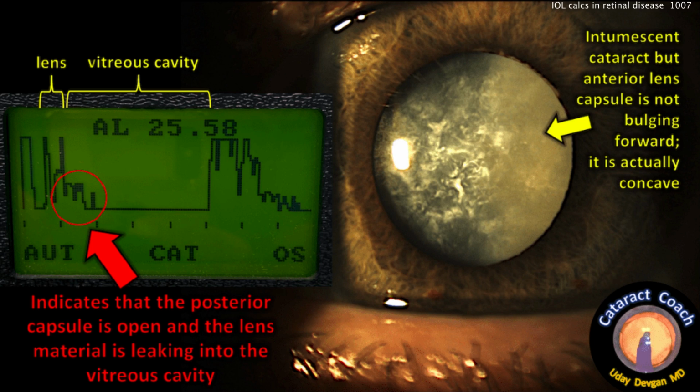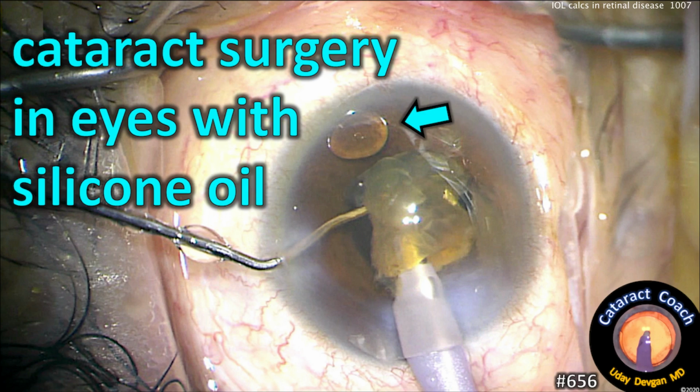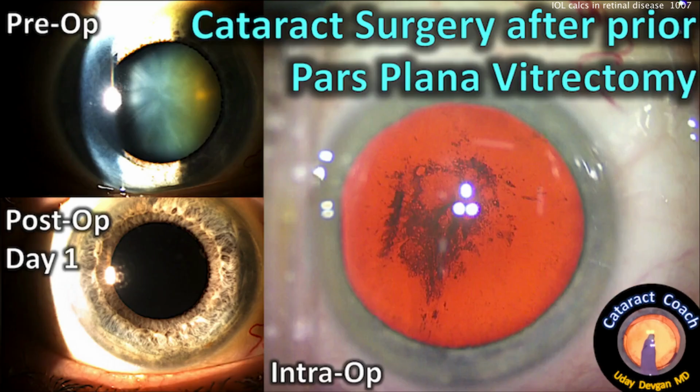cavity. So at the pre-op exam at the slit lamp, we can see that this lens capsule is not bulging forward. Actually, it's concave. The nucleus has already fallen into the vitreous cavity. If you're going to do cataract surgery in an eye that's going to retain silicone oil, that has to be done differently. We'll talk about that. We should add power to avoid post-op hyperopia.